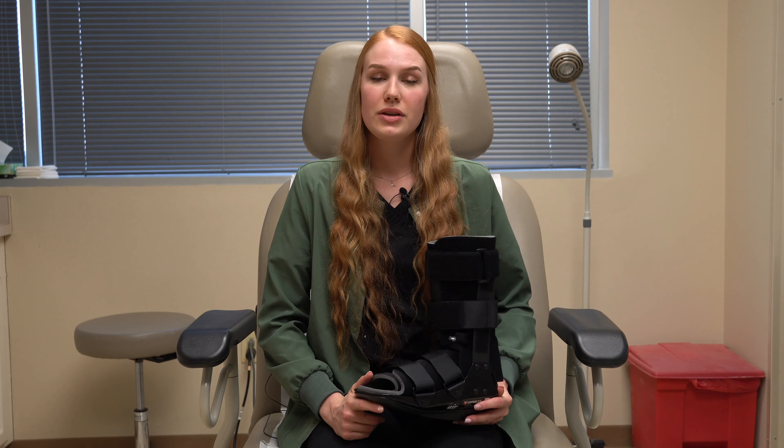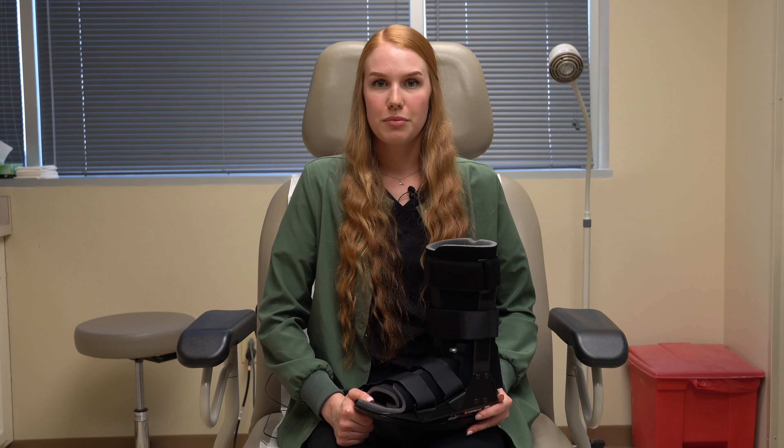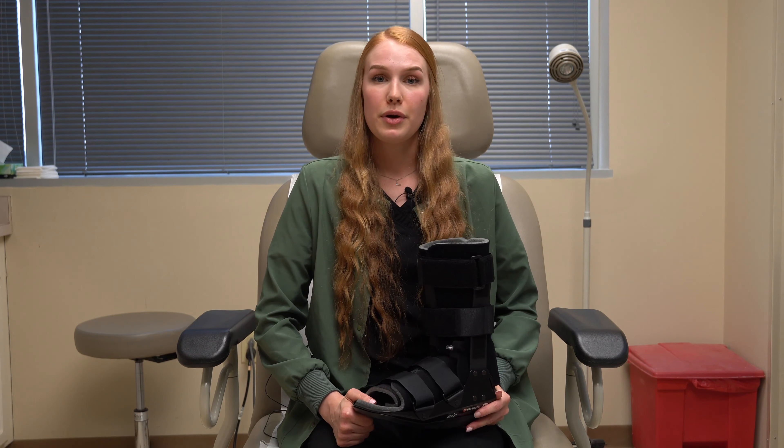A cam boot is a medical device that we use to stabilize your foot. Typically we use this on patients who have fractures or plantar fasciitis. In this video, we'll provide instructions on how to properly wear your cam boot.